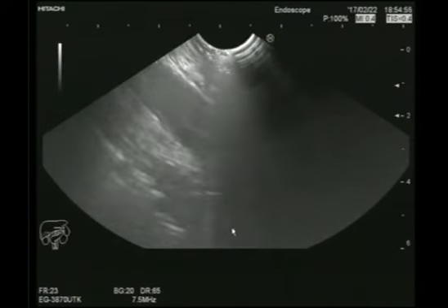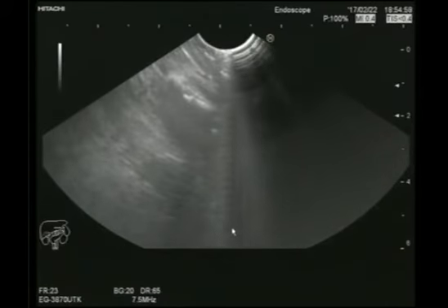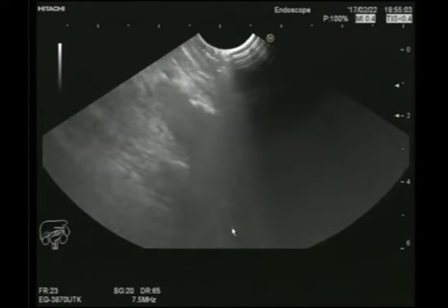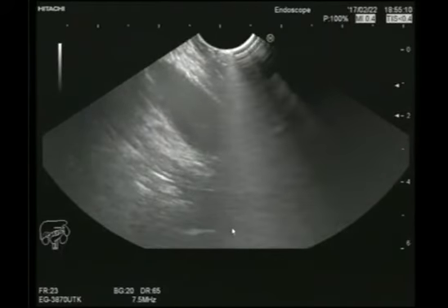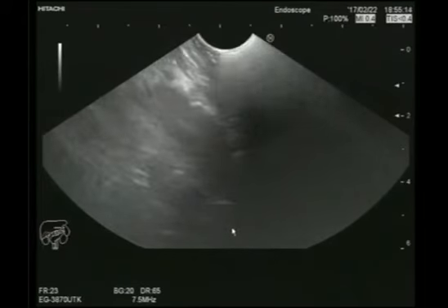That is a very important maneuver. The people who are coming to my unit to learn the basics of endoscopy, this is the first maneuver I show them. You intubate the bulb, then you do a right up, and you turn your body to the right, and you actually withdraw the scope. With sliding, you are going to find your way to the third part of the duodenum.